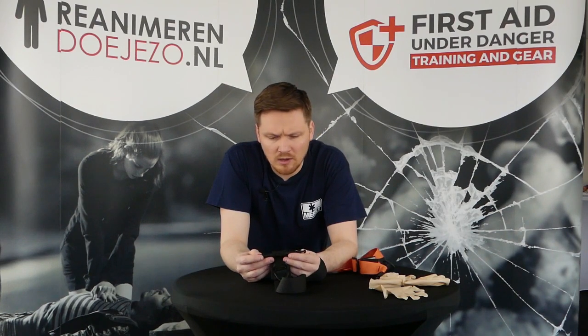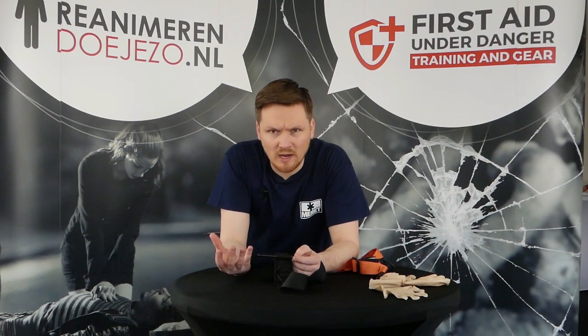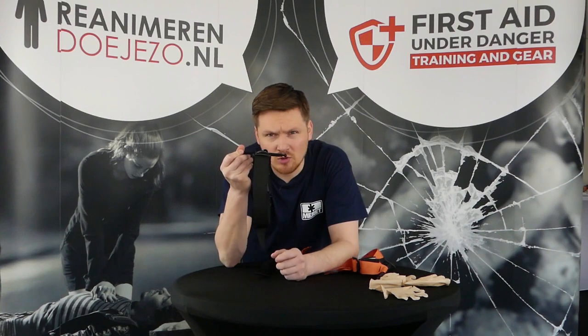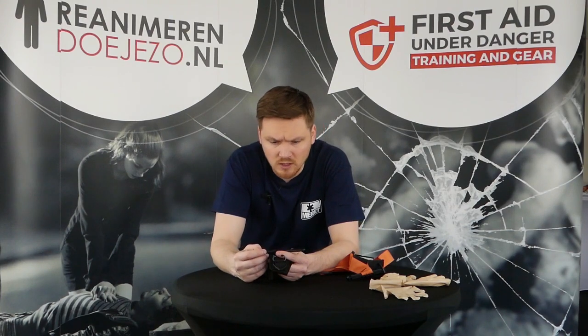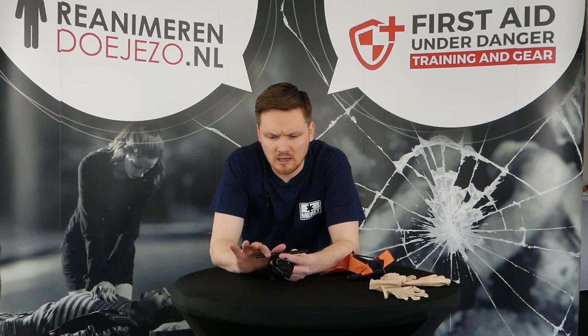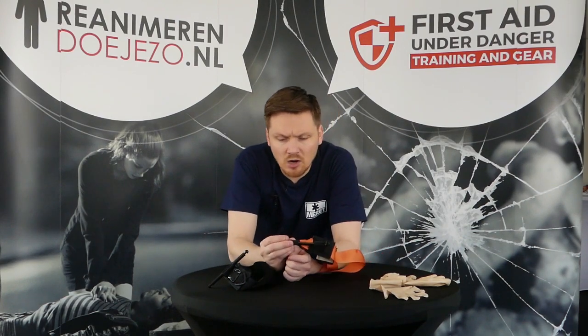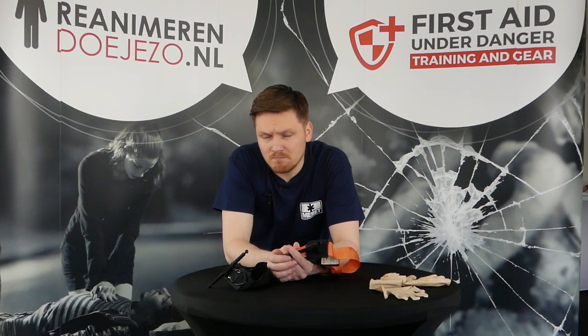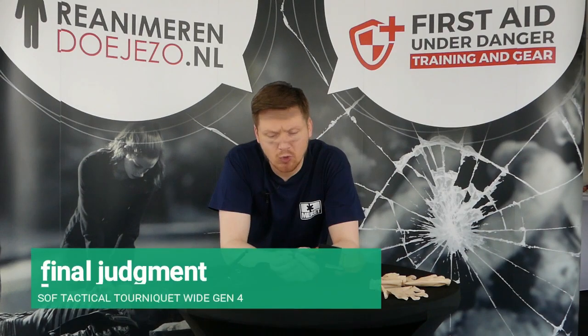I'm gonna look up if I can find why there is a different pattern on there, if they thought about it, if this is any better than it was, or maybe because if you have wet gloves, this from the Generation 4 might perform better than the pattern that this has, because this has deeper grooves. So yeah, if you have some blood on your hands, it can easily go through the grooves that are in the pattern of the new generation, the SOF-T Generation 4. And these aren't very deep patterns, so that might be a reason, but I'm not 100% sure. I'm just guessing. I need to fact check that for you guys and girls, of course.